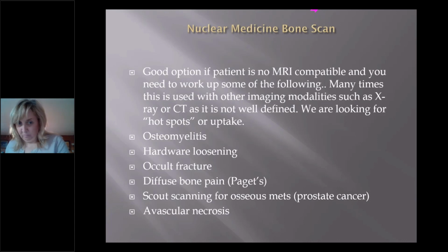probably a better test. Hardware loosening, MRI is not a great test for that. You get too much artifact. So, a lot depends on what you're looking for. And these are good examples where, if you're not sure, check with radiology and they can give you the better answer.